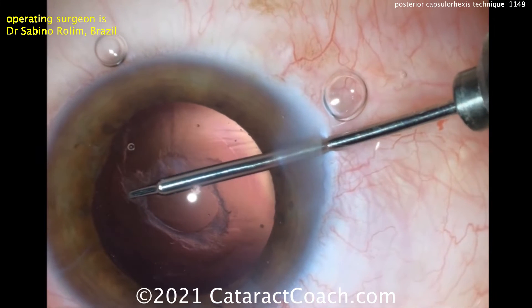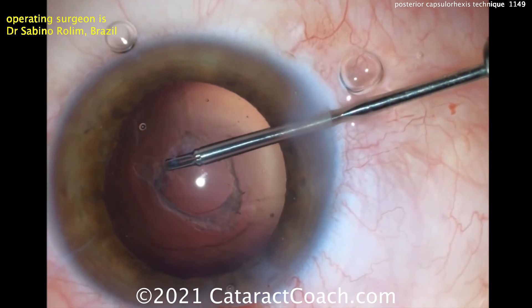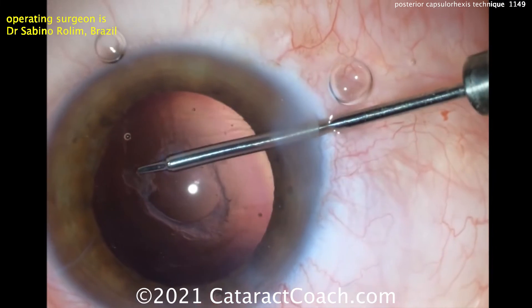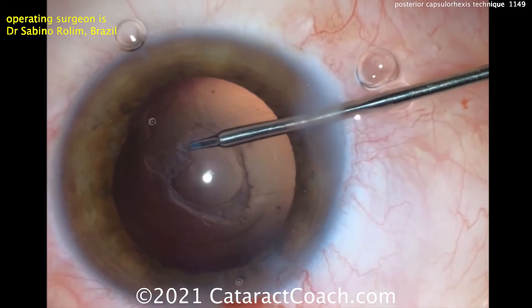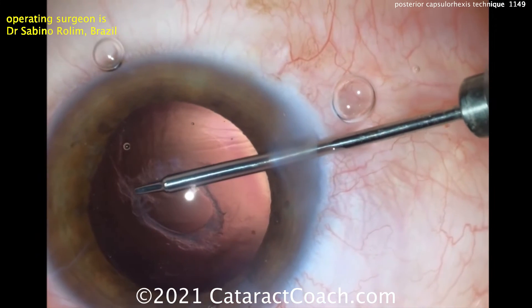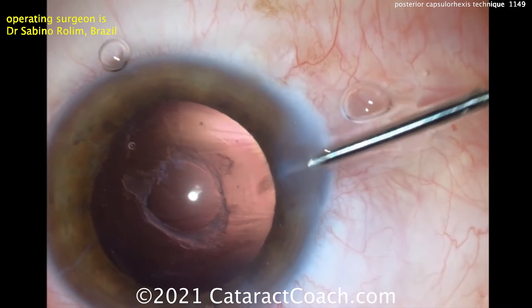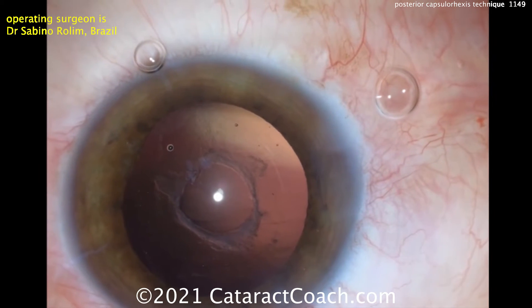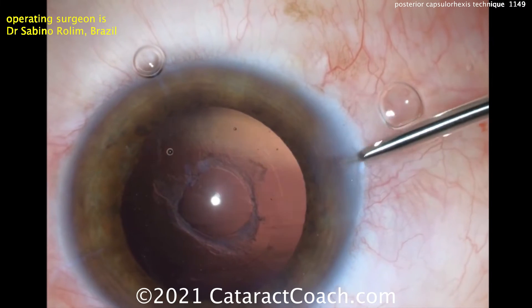In general, you probably want to aim for about a four millimeter posterior capsular rhexis. In some ways it's a little bit easier to tear than an anterior capsular rhexis, because the capsule you're working on is bowl-shaped instead of dome-shaped like the anterior capsule. With this fibrotic area, you've got to be careful, because you can get it to run out very quickly, and you don't want that situation.